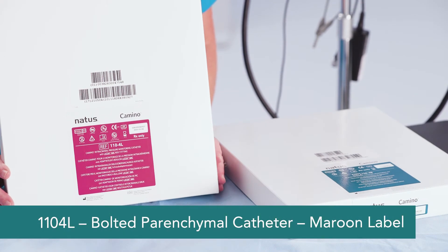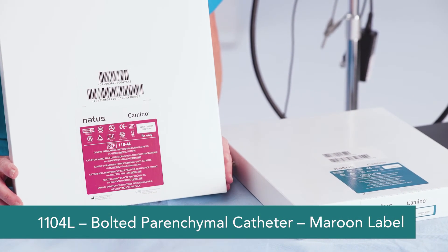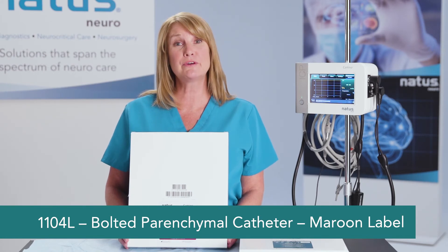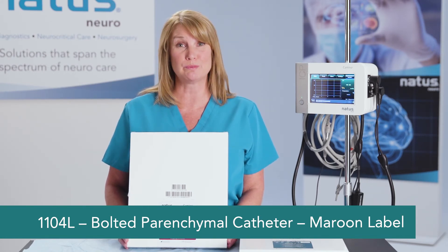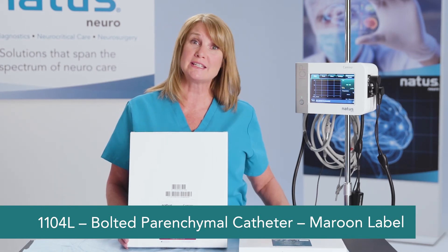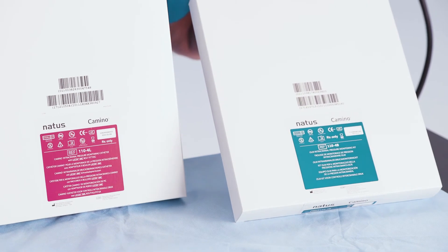That concludes the placement of the 110-4B catheter. Note that the Camino 110-4L catheter is also a parenchymal bolted catheter; however, it is placed through a multi-lumen bolt and is not interchangeable with the 110-4B parenchymal catheter.